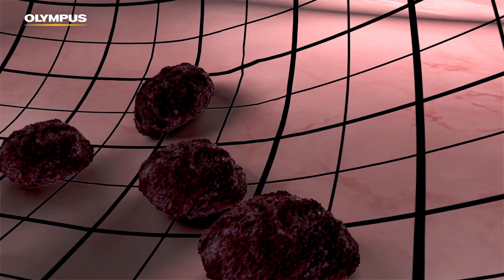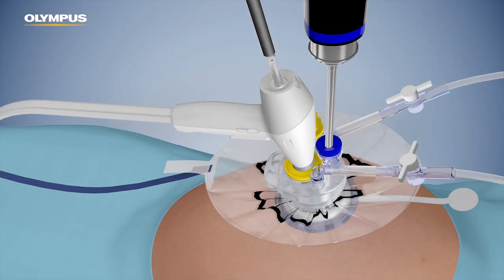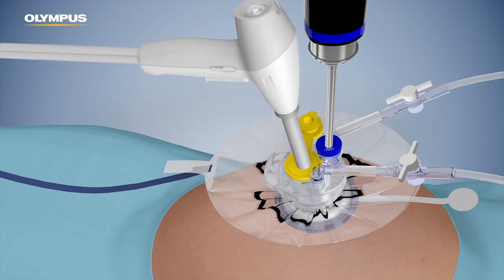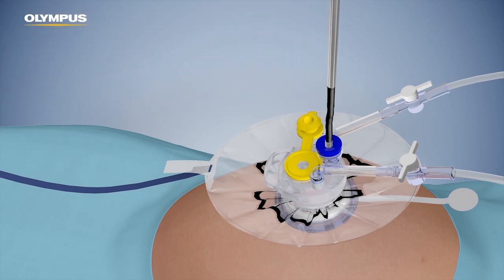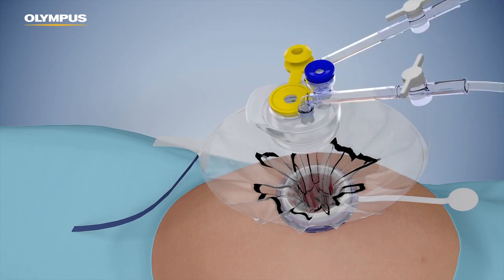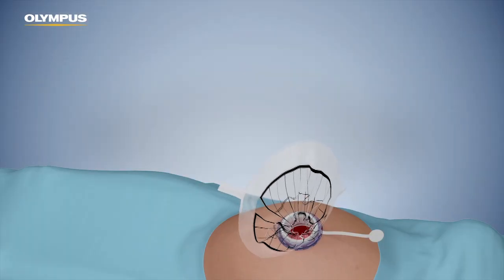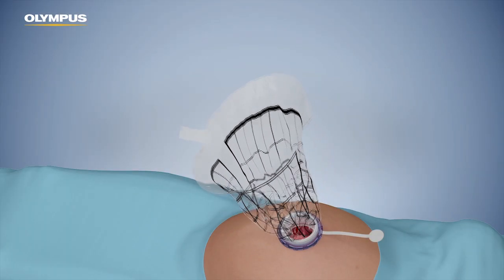Once the specimen has been reduced sufficiently and only small bits in fluid remain, remove all the instruments, ending with the scope. Detach the boot and gently pull on the pneumo liner while keeping the neck open to ensure that gas can escape.